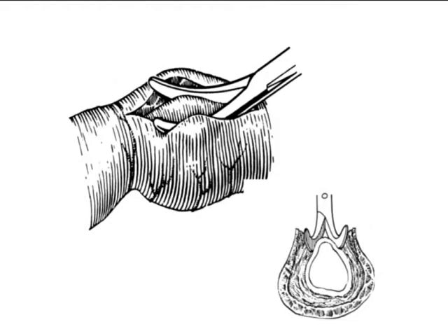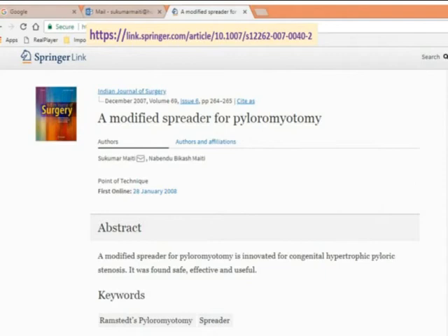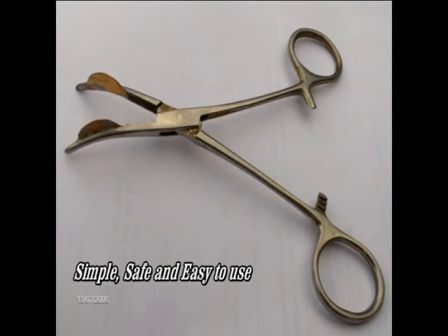This technique is improved by adding two semicircular blades to the shoulders of the forceps. The instrument is simple, safe, and easy to use. It also ensures a complete myotomy.